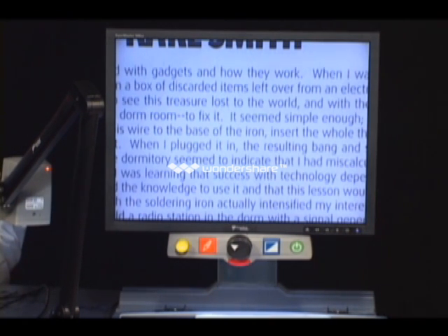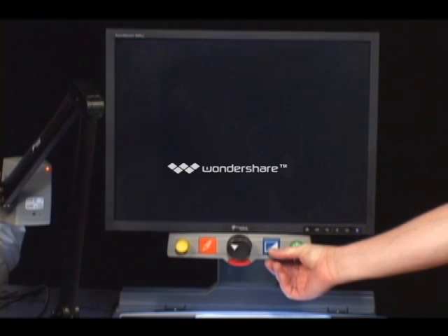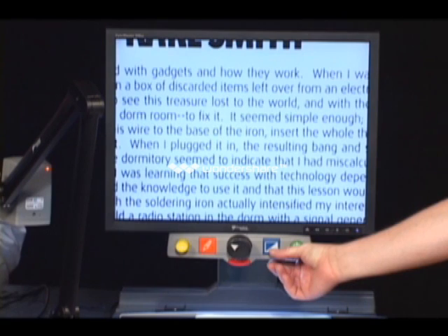Now, the other thing we want to show you are the color changes. The Topaz unit actually will set up to 24 different color combinations. The default setting, when you get the machine out of the box, as we did today, there are 6 different settings that they put up here, and we'll go through those. Right now we should be on full color. Yep. You hit it the first time, we should be on, is it black and white? Yeah, this is high resolution black and white image.